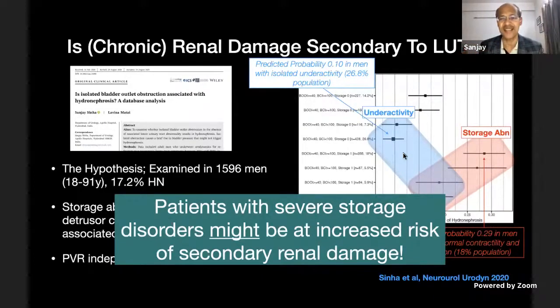And you must have seen this. There are patients, for instance, young men with primary bladder neck obstruction who come to you with a creatinine of 5. And you do their urodynamics, you find that they've got bad outlets, but they have consequentially also developed bad storage, or that they have very large residuals and they have damaged their upper tracts. So the storage is extremely important.